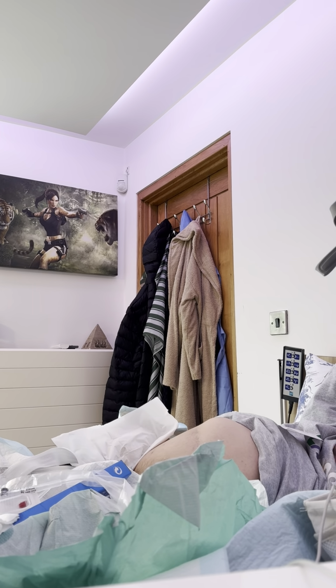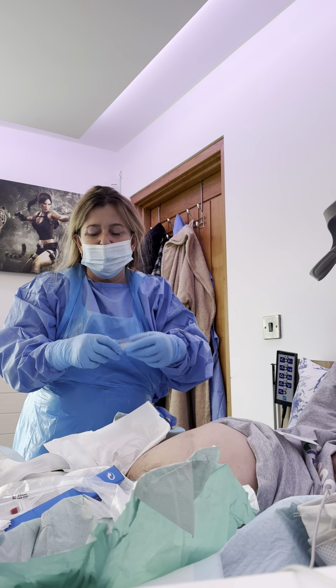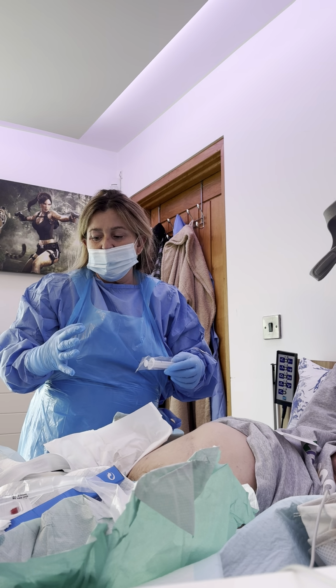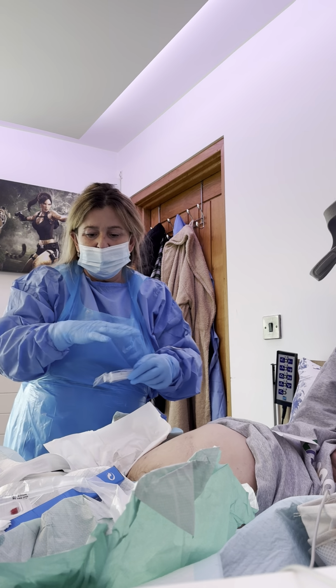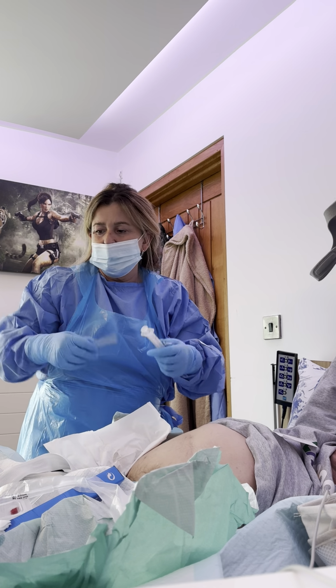You're going to see all these stickers on my arms. I'll carry on getting on with this at the same time. The stickers are on my arms because I need to keep the reference numbers, as we've had 4 suprapubic catheters that have failed due to the balloon. I've put videos up to state the reasons why. So the first thing I'm going to do is get the balloon out.